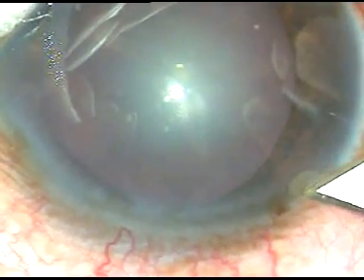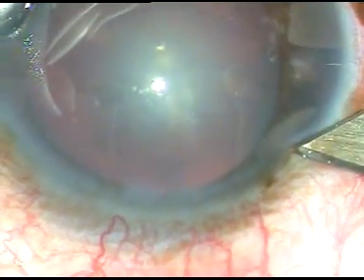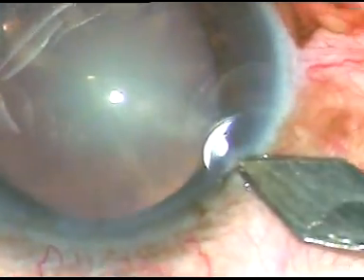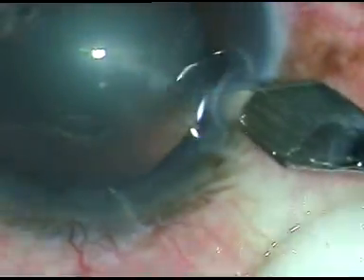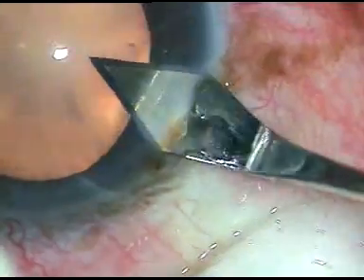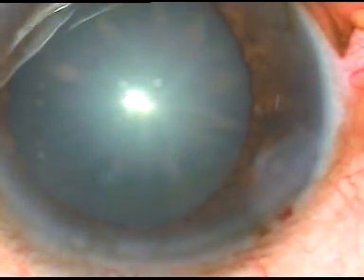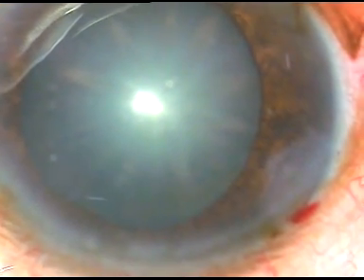Dear colleagues, this is a traumatic cataract. This patient sustained blunt trauma in this eye about 1 year ago, and we have taken up this case for surgery. I know that there may be zonular weakness and I may have to place a CTR, so I have kept a CTR ready for this case.